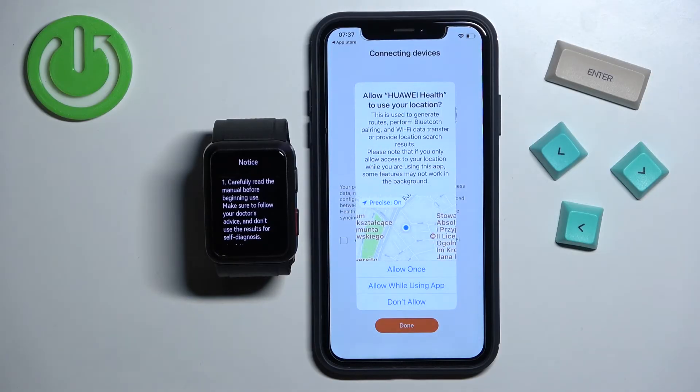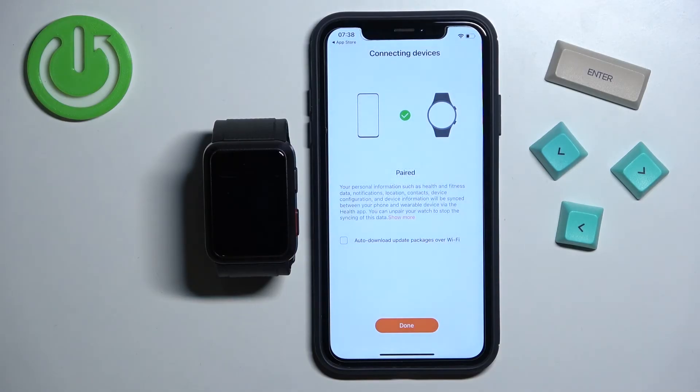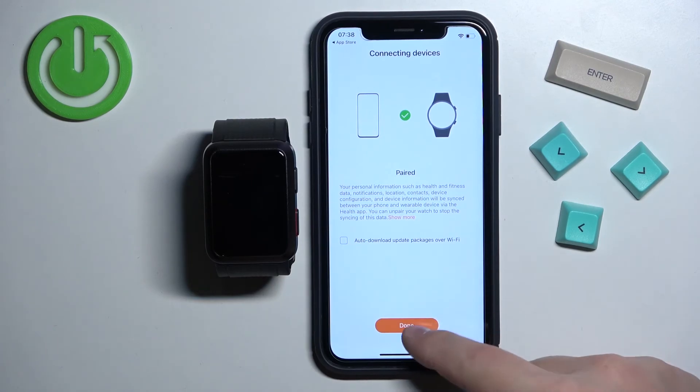Right here we can allow the permission for location — this is useful if you want to track routes when you're running and stuff like that, so allow it if you want or deny it if you don't. Now there's a pop-up about contacts permission: if you want to receive notifications about calls and who's calling you on your watch, allow this permission. You can also check the box to enable auto-download updates via Wi-Fi, then tap on Done.